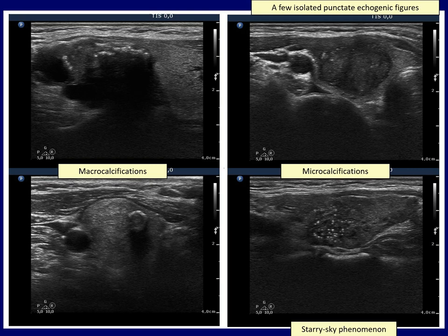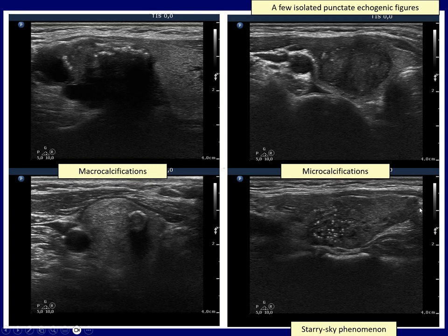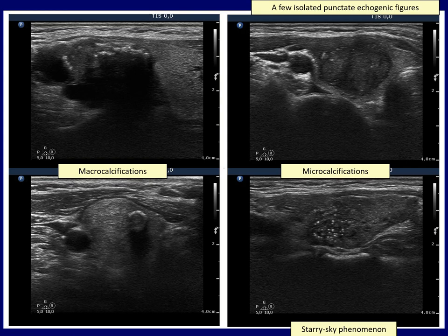The left two images present coarse or macro calcifications, the lower one the so-called eggshell form. In both cases there is an anechoic band dorsal to the primary focus — this is the acoustic shadowing. The right cases proved to be papillary cancer. There are a few isolated punctate echogenic foci in the upper tumor. The lower image presents the so-called starry sky phenomenon, when multiple microcalcifications are present.